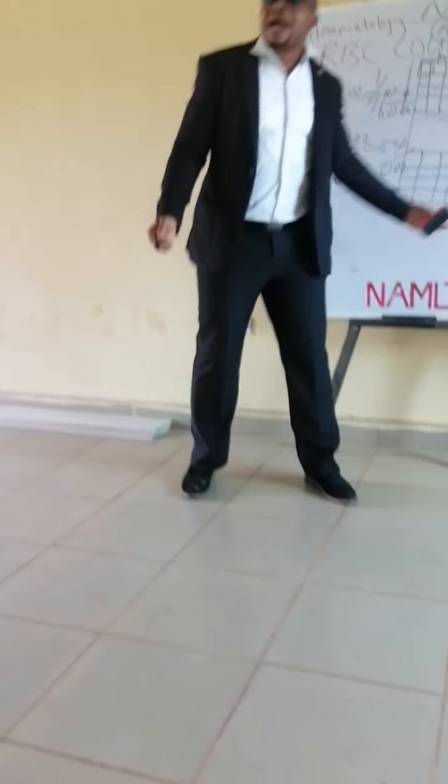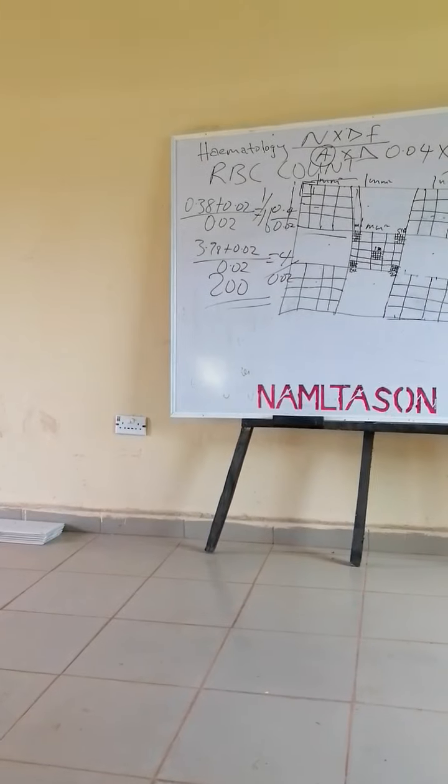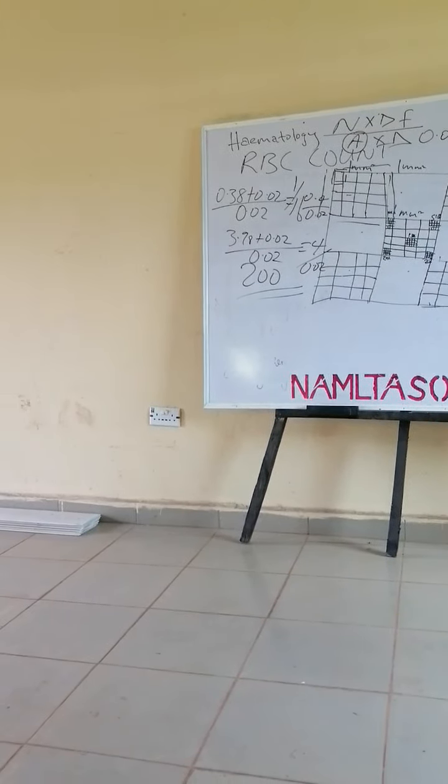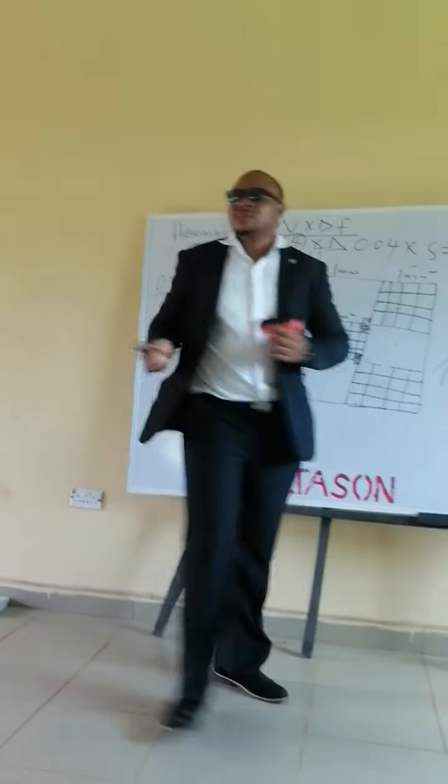Are you also informed that each of the counting areas are surrounded by triple lines? I was expecting a loud yes. Under the times 10 objective. Now, hear this if you've never heard this. When counting WBC, you use lower magnification, which is the times 10 objective. That's one.